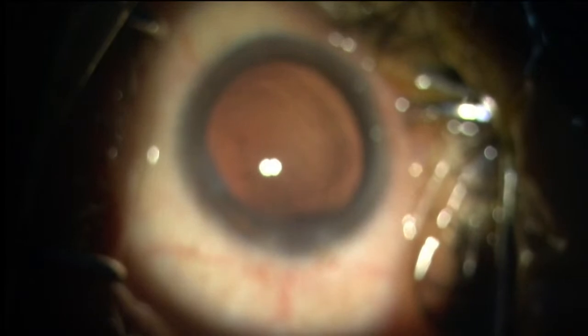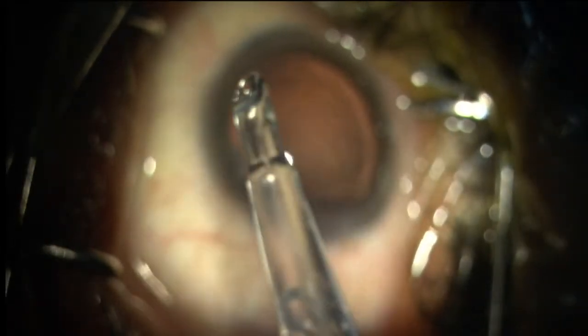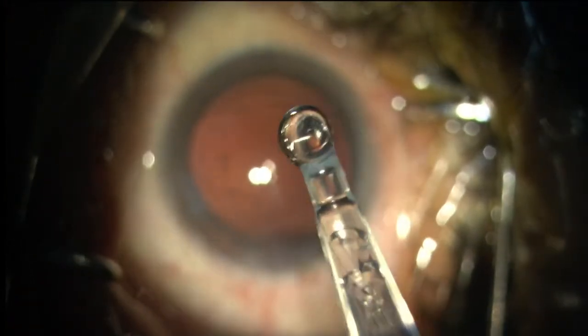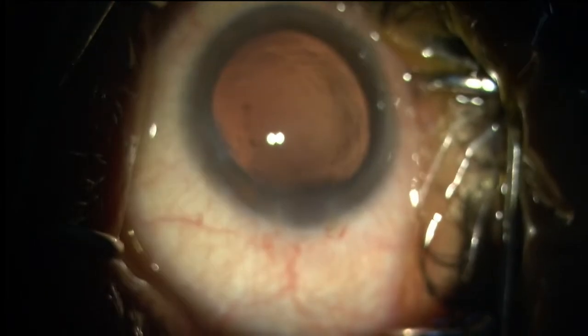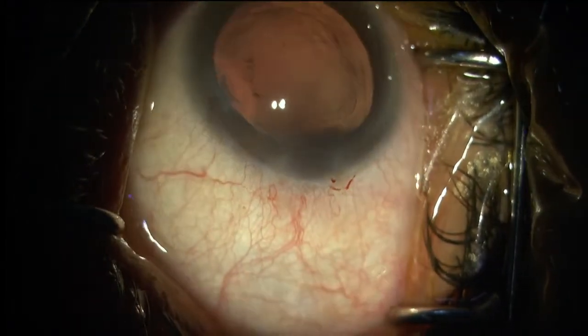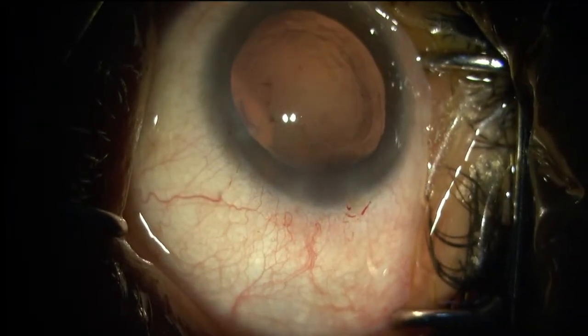So this is my actually preferred lens. Even if you want to have a perfect distance vision, and some of the patients may be demanding, I can use it for reading. Because this lens has a very good landing, even if the patient is plus 0.25, he will have a perfect vision for 6/6. That means if the patient wants primarily a distant dominant vision, use it as a synergy. When it is plus 0.17, plus 0.25, there is no problem.